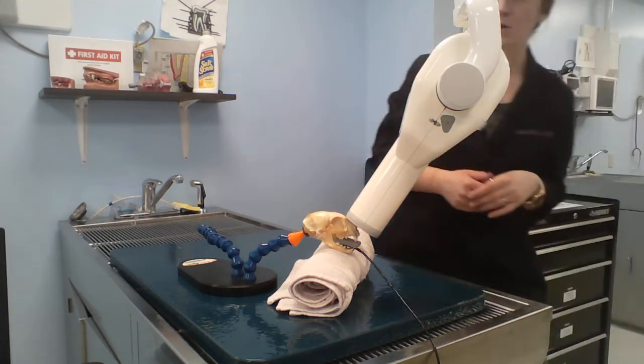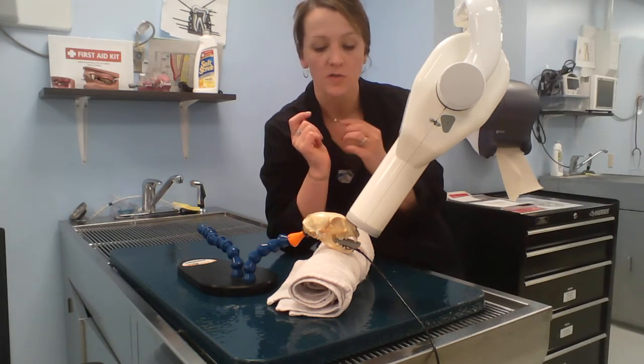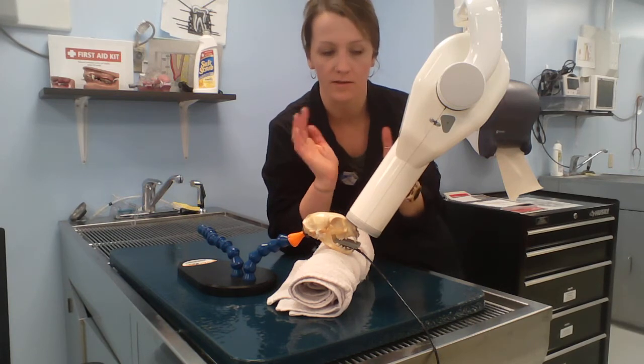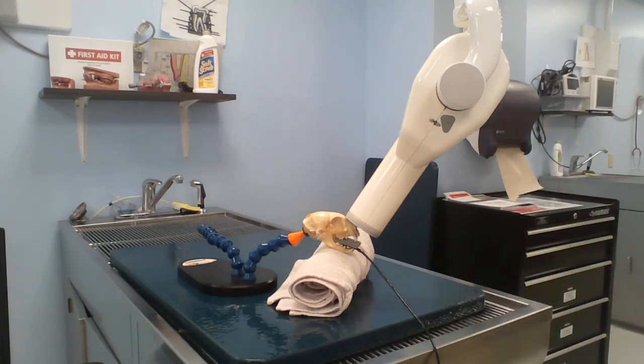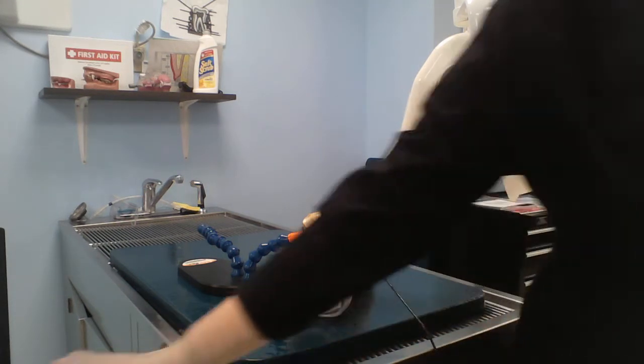Cats' canines are not as long as dogs', so they're more straight up and in, so we don't usually have as many issues with imaging them and cutting off the roots unless your angling is really off. Again, we're going to come out of the zone 6 feet away, expose. And then we will look at our x-ray.